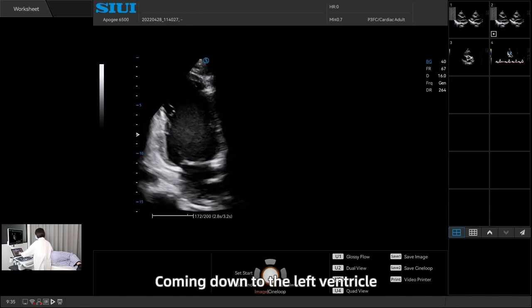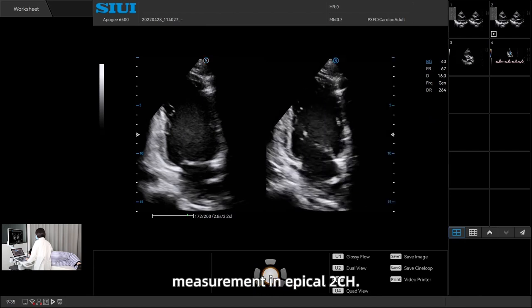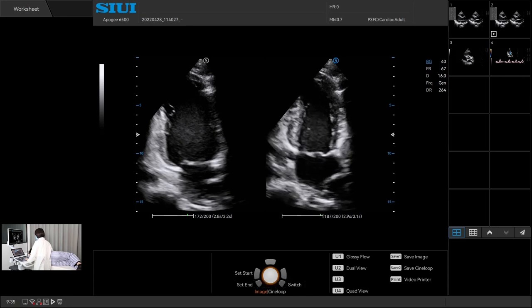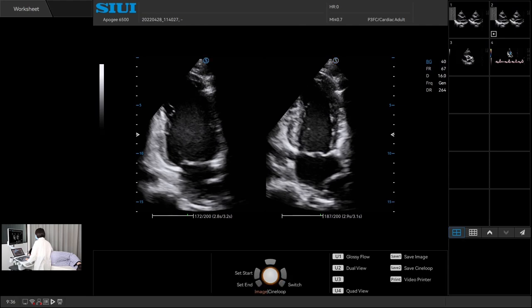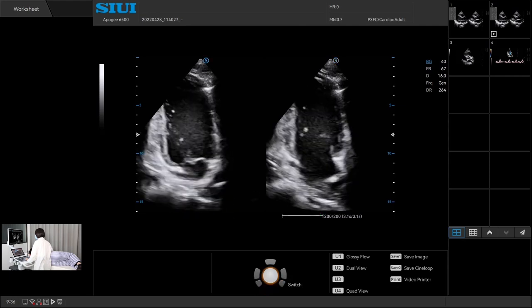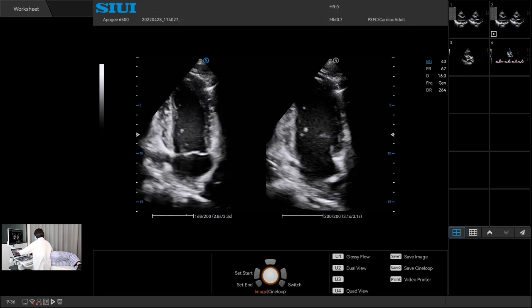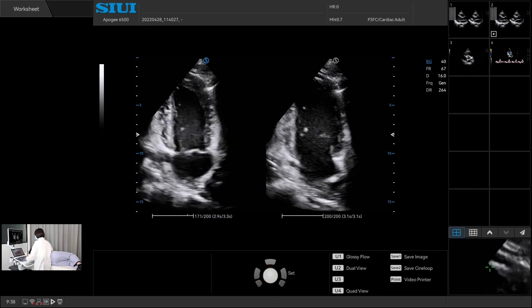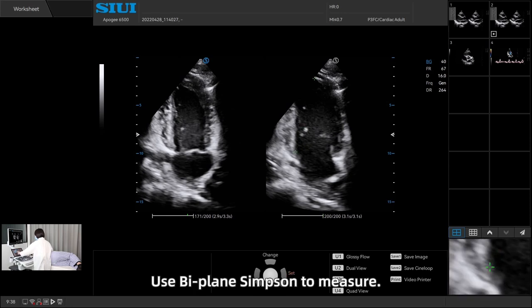Coming down to the left ventricle measurement in apical 2 chamber. Then we enter 2B mode. Obtain two images in both diastole and systole. Use Biplane Simpson to measure.